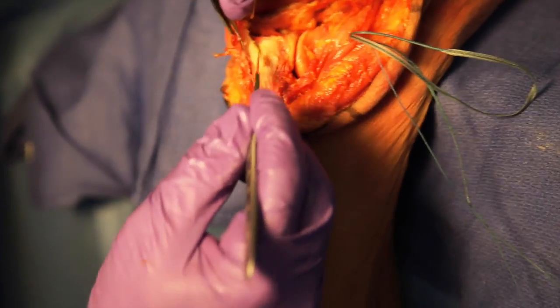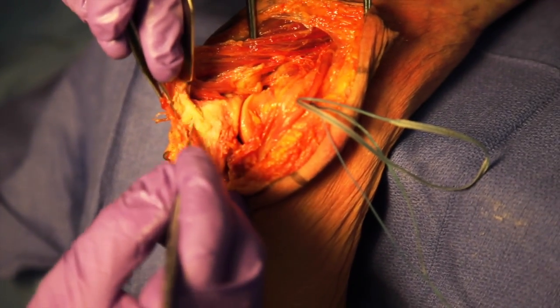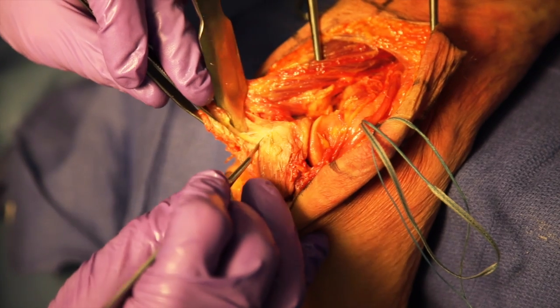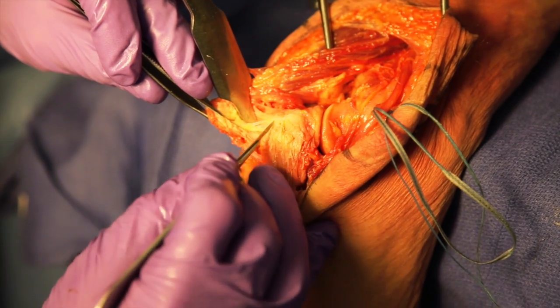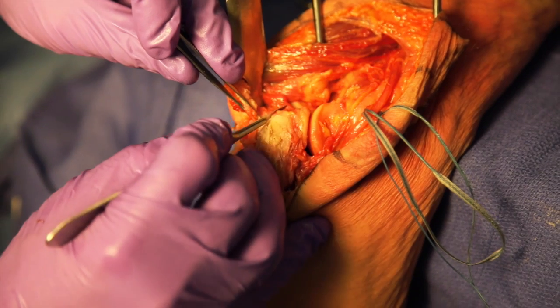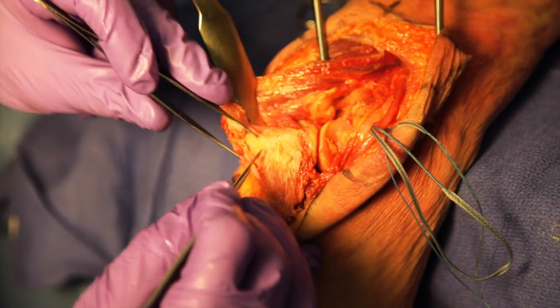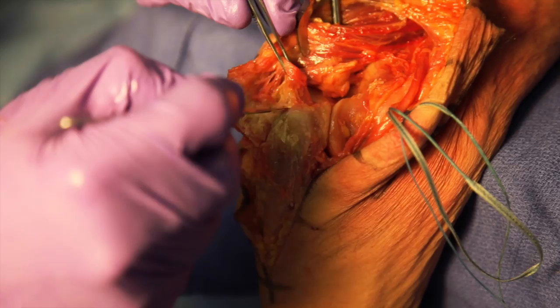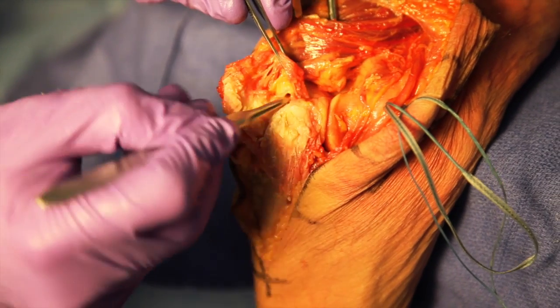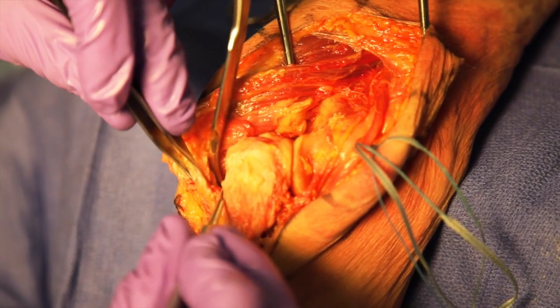Next, the triceps, forearm fascia, and periosteum are elevated off the olecranon from medial to lateral as one unit. The forearm fascia incision should extend 6 centimeters distal to the olecranon. It can be helpful to extend the elbow to 20 or 30 degrees to relieve tension on the tenuous tissue as the flap is raised.